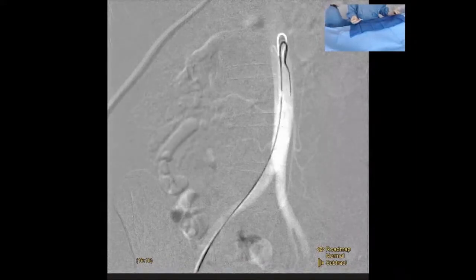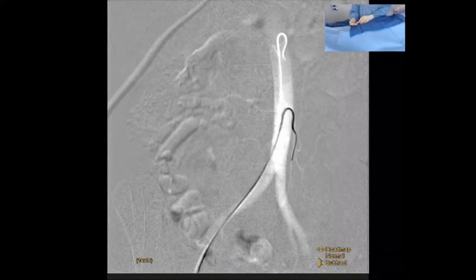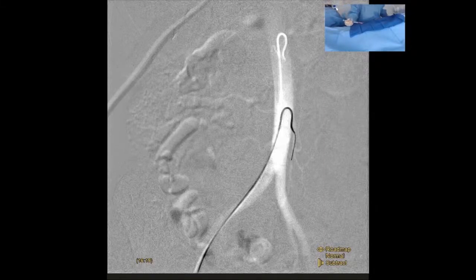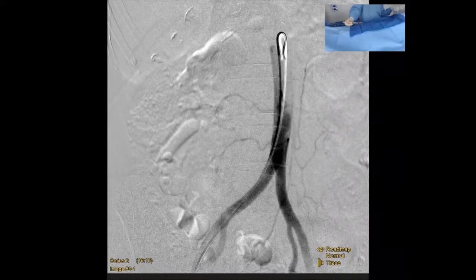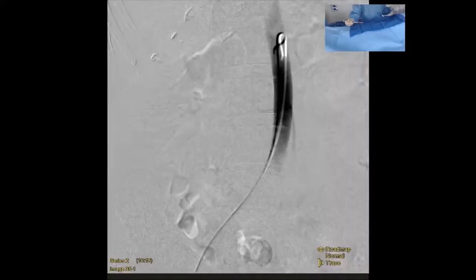Very good. So the first target for hemorrhoid embolization are branches of the superior rectal artery, and therefore you have to get into the IMA to start. You got it. So what are some challenges about the IMA? One thing that's important is imaging your aortogram here like we just did and getting into the IMA, RAO projection. It typically arises at L3, L4. There's really good imaging on her, but hers might be a little higher; you'll see it arise at L2, L3. So we tend to use a reverse curve catheter, like a SAS, to get in.